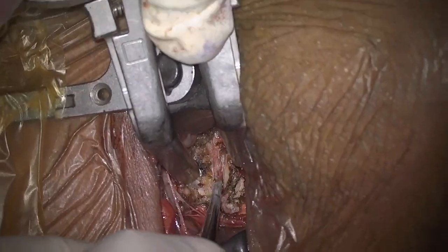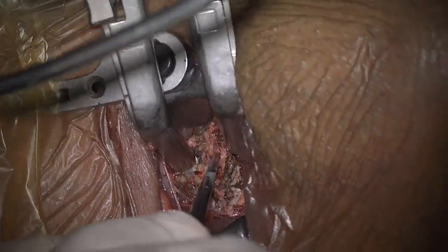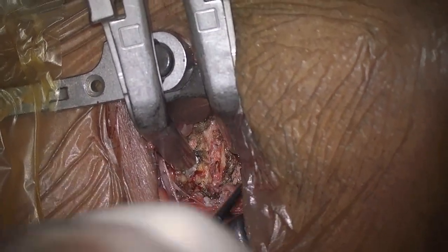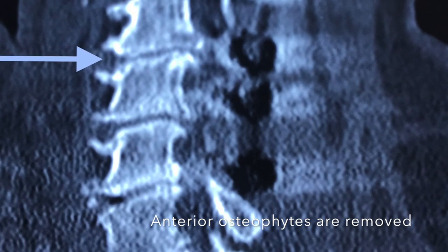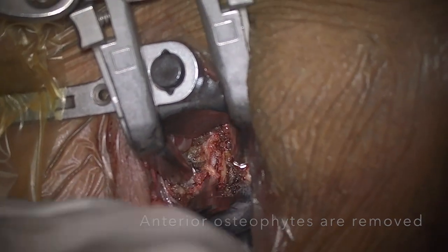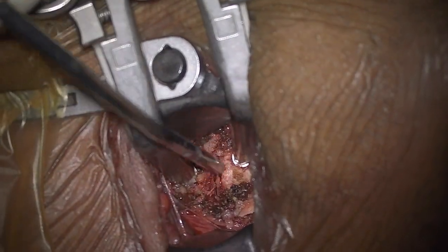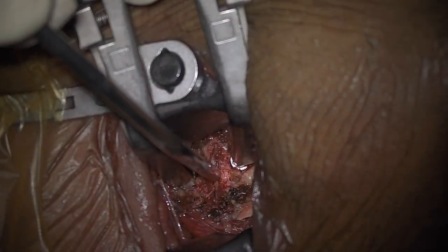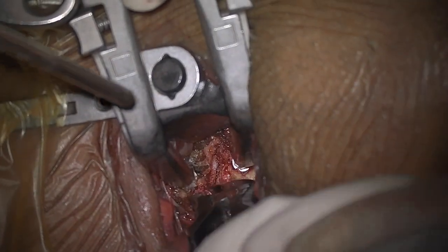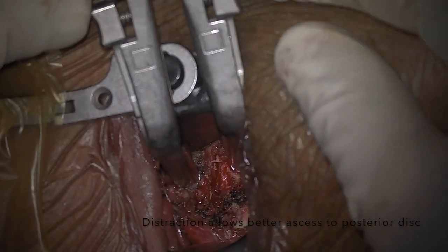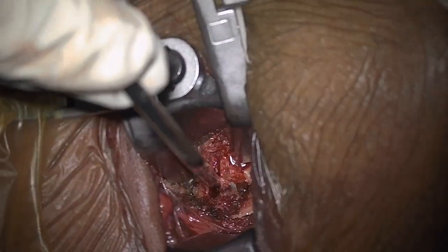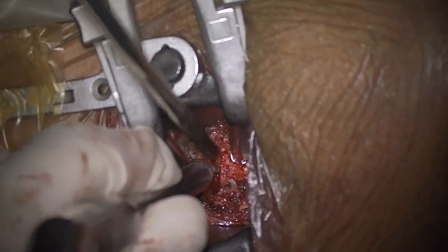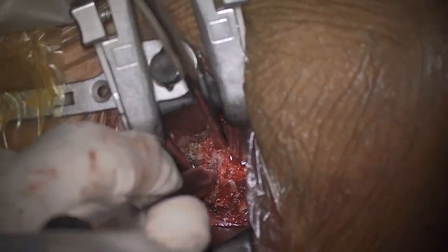Once the outer annulus has been cut, curettes can be used to remove the hard disc. In cases like this one, it is important to remove any anterior osteophyte, which can be pre-seen on the CT, because any anterior osteophyte will obscure your vision in order to reach the middle and inferior part of the disc. Once the osteophytes are removed, the disc space is distracted over the distractor pins.